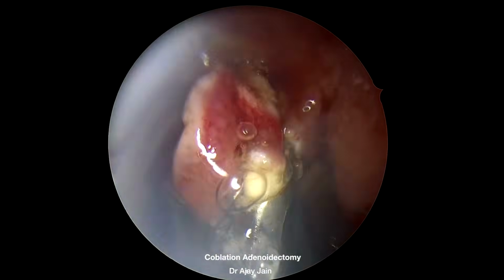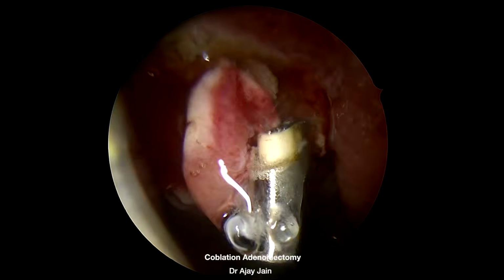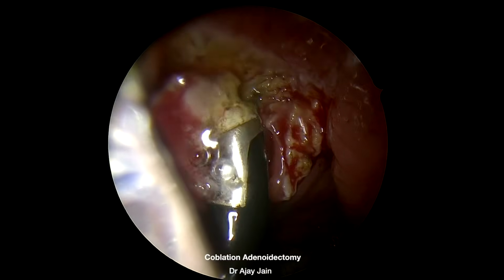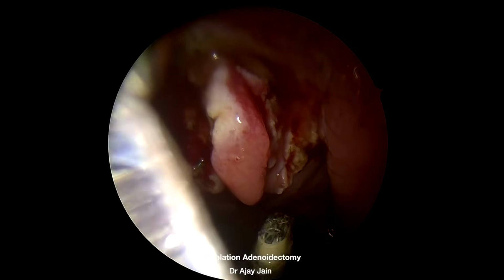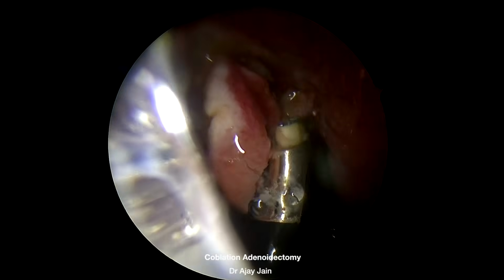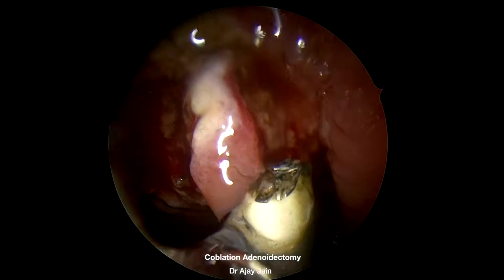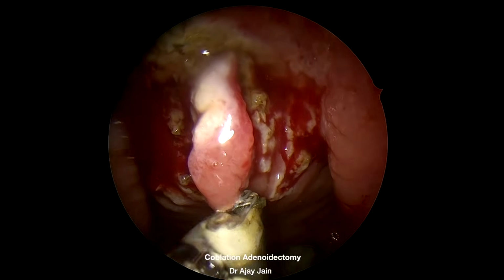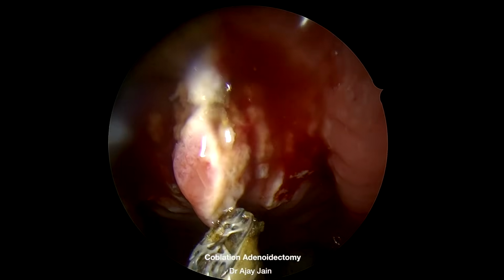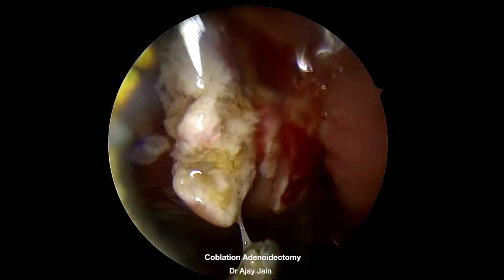Now I am going towards posterior superiorly. I intend to clear the left fossa of Rosenmüller as well. Never ignore even a minor bleeder. Assuming that bleeding will stop spontaneously is a poor surgical practice. Every bleeding point should be identified and controlled before concluding the procedure.